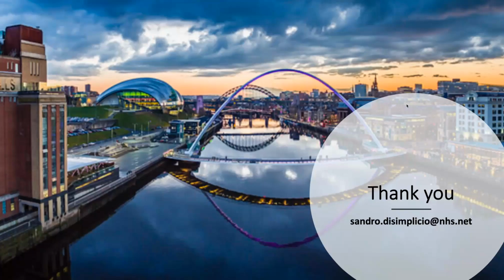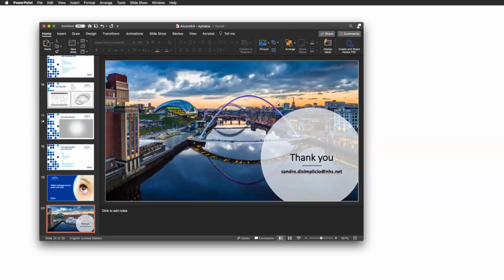The first question that's come in: where is the ideal position to grab the T at the end of the Carlevale lens, the vertical or horizontal part, to reduce damage from manipulation?